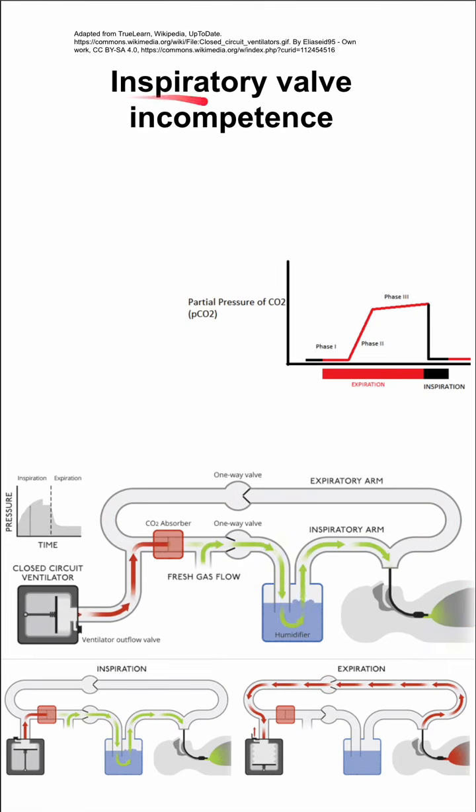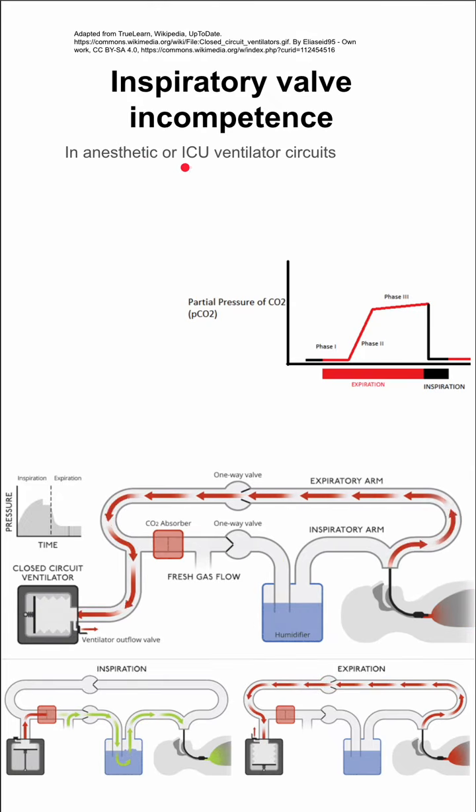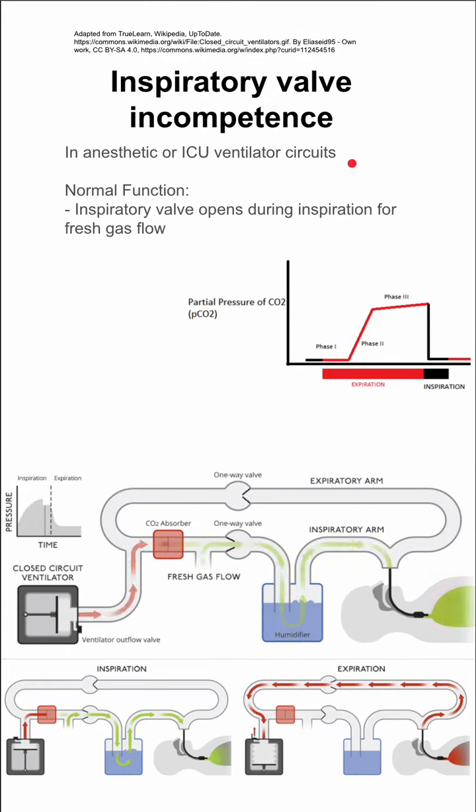Here are some notes on inspiratory valve incompetence. This is relevant to anesthetic circuits or ICU ventilator circuits. The normal function of the inspiratory valve is as follows. The inspiratory valve should open during inspiration of fresh gas flow.